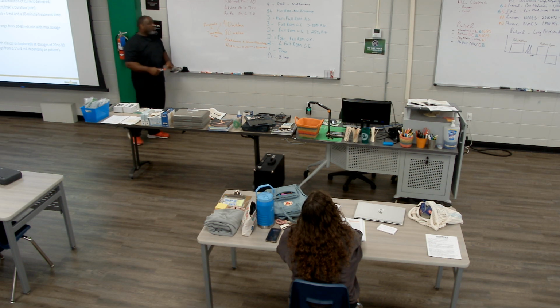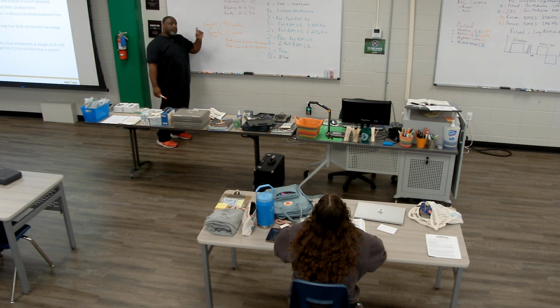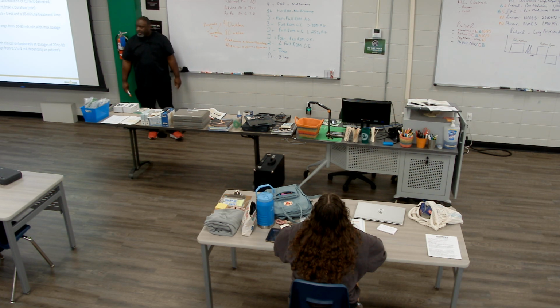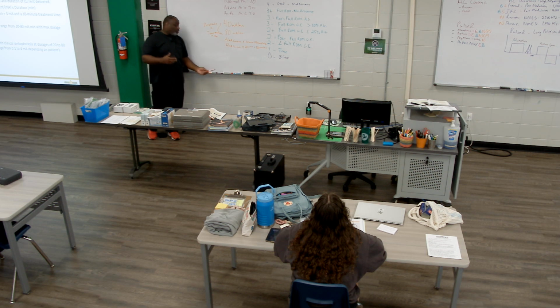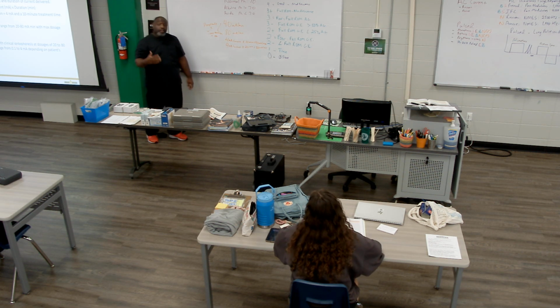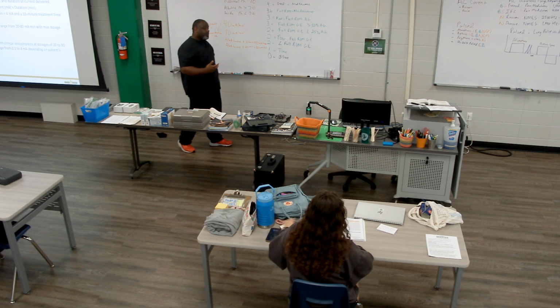You turn it on, and the patient can't tolerate more than 1 milliamp. So you're going to have to do 1 milliamp of current for 40 minutes. Does that make sense? Whatever the patient can tolerate affects the time of the procedure. There's no guarantee your patient is comfortable tolerating 4 milliamps; that's pretty high for DC current.